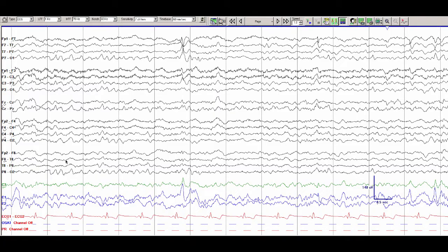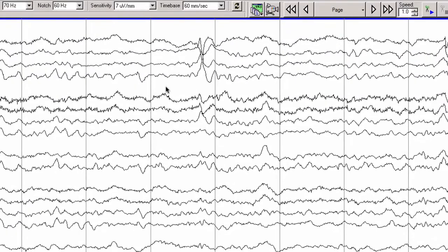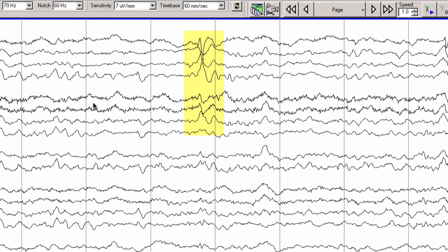Let's compare a small sharp spike to a typical left anterior temporal sharp wave as seen in this patient. You can see near the center of the page a very high amplitude, long duration, sharply contoured waveform which extends throughout the left temporal region with a field also into the left frontal region to some extent.